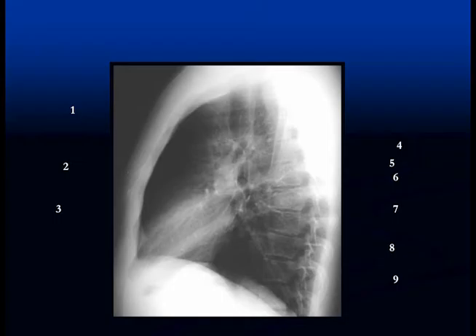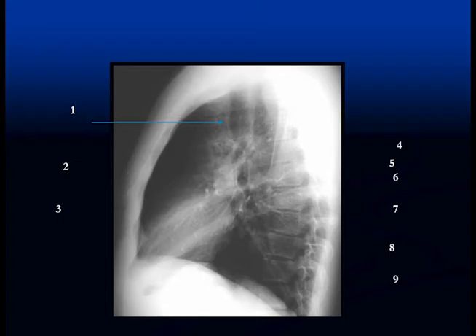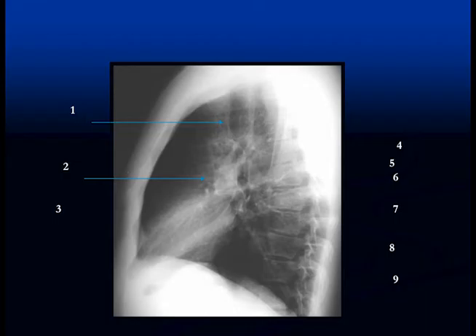Now we'll go on to the lateral chest film. A lot of medical students and doctors tend to avoid the lateral film because they find it difficult. But if you concentrate on the airways in the center — you can see the trachea coming down and where it bifurcates below — then you can describe the structures in front of and behind the trachea. This is the right pulmonary artery, which sits in front of the airway on the right side.